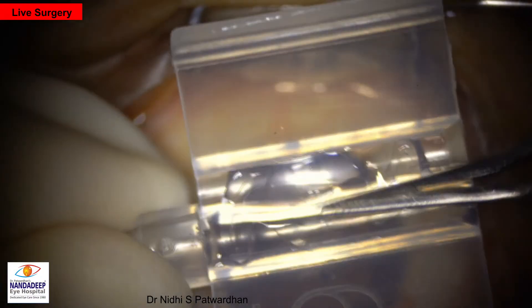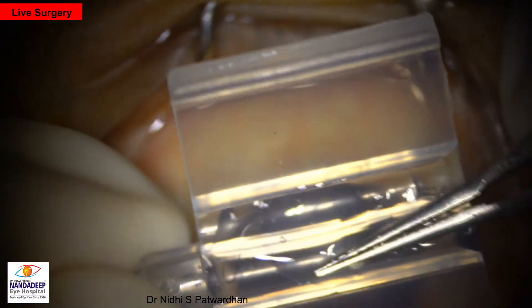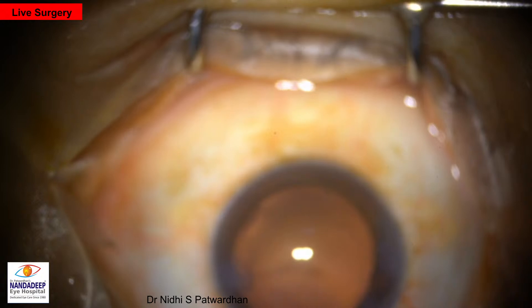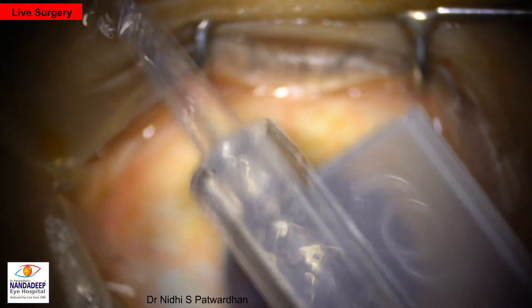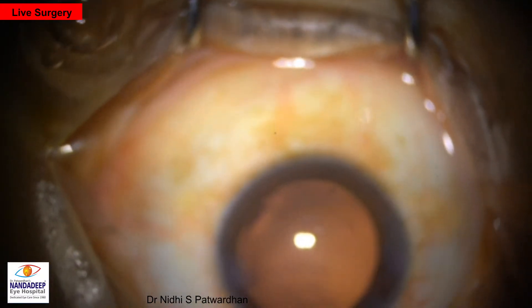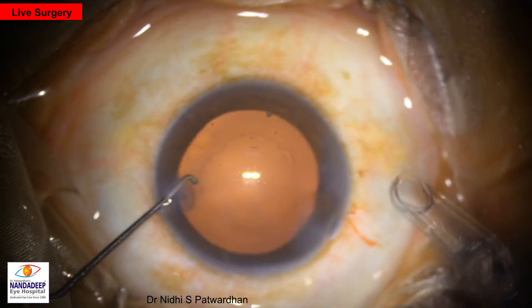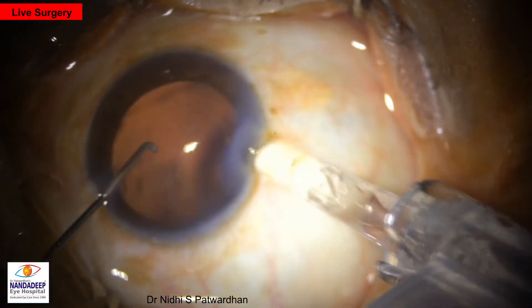This is a hydrophilic double-haptic IOL, a very standard IOL, and with this design one has to be careful while loading. Make sure that both haptics are in the groove and are not outside. After loading, make sure that when you push the cartridge, do it in multiple steps and not in a single step. This avoids catching of the haptic between the silicone plunger and the cartridge wall. Follow these steps in each case, otherwise you may have a trailing haptic cut which may need explantation of the IOL.